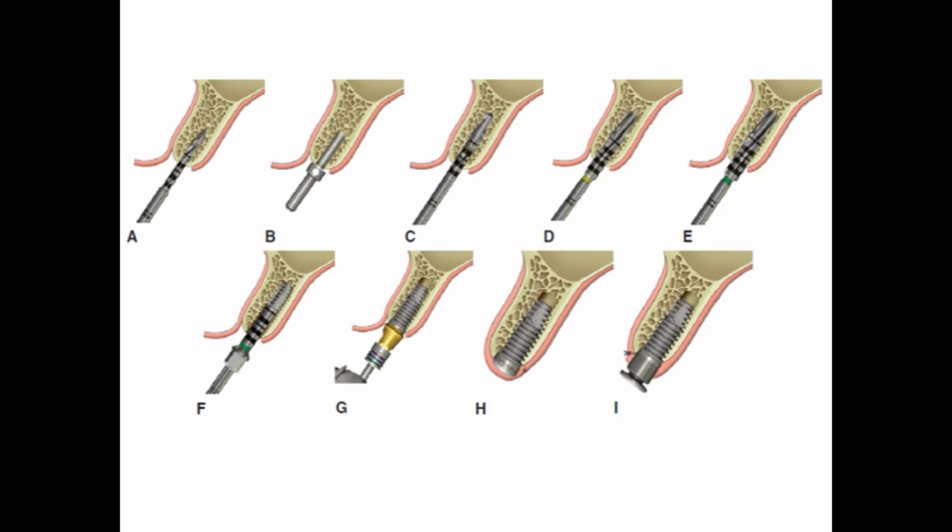Now the implant osteotomy. After the soft tissue is reflected, a 2 millimeter diameter pilot drill is positioned in the mid-mesiodistal and faciopalatal aspect of the ridge and proceeds 9 millimeters within the bone under copious cooled sterile saline. Then a 9 millimeter long direction indicator is positioned into the site for evaluation. After that, the 2 millimeter diameter drill is reinserted to the final depth position. Most often, the drill prepares the bone 1 to 2 millimeters deeper than the length of the implant, of course when the opposing landmark permits.